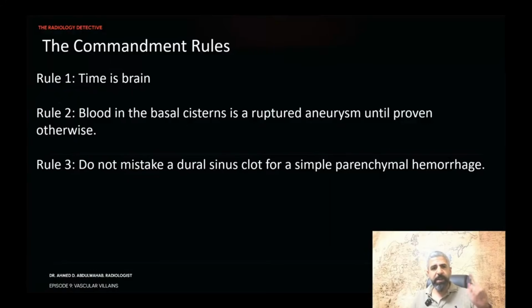Rule number 1, time is brain. Know your hyperacute stroke signatures. Rule number 2, blood in the basal cisterns is a ruptured aneurysm until proven otherwise. Rule number 3, do not mistake a dural sinus clot for a simple parenchymal hemorrhage.